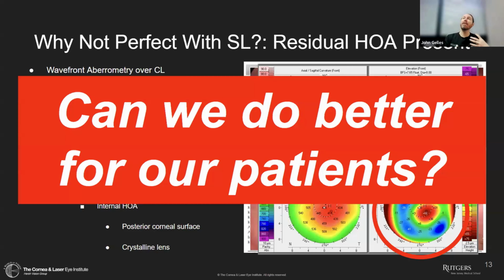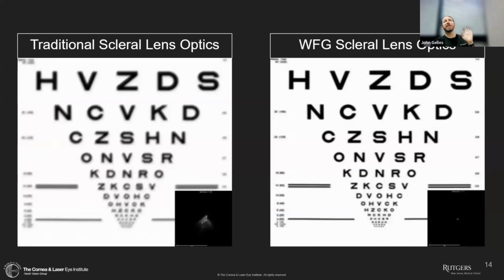And the question is, can we do better for our patients? Can we get them better quality of vision? So what you're going to see here is the comparison between traditional optics and the wavefront guided scleral lens optics.